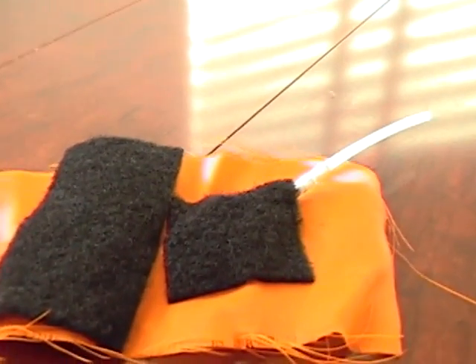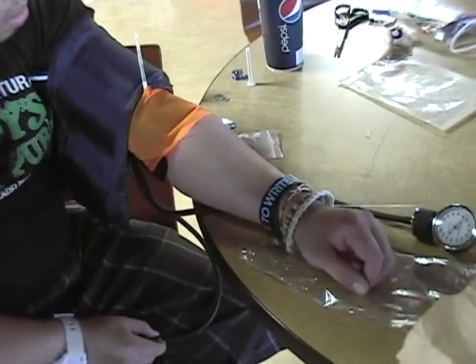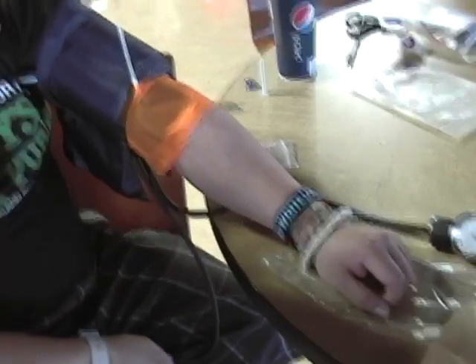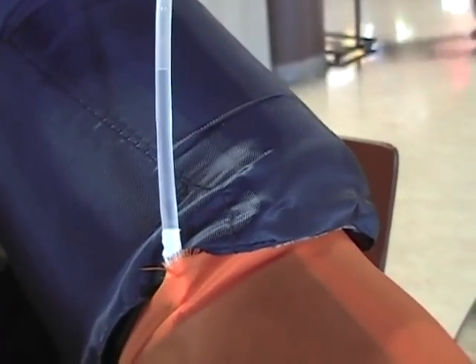All junctions are sealed with epoxy, and the device is then filled with water dyed with a deep red color. The device is fixed to a detachable cuff secured by Velcro straps. Our device is designed to be used with a typical sphygmomanometer. The sphygmomanometer is secured onto the upper arm, while our device is secured slightly below it.